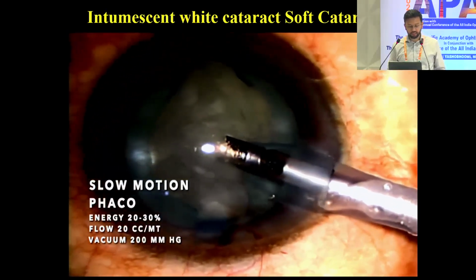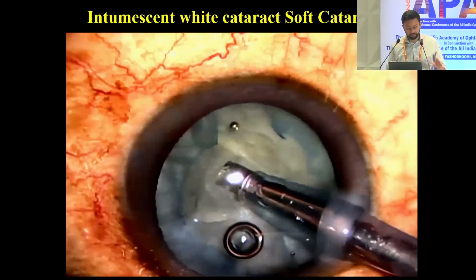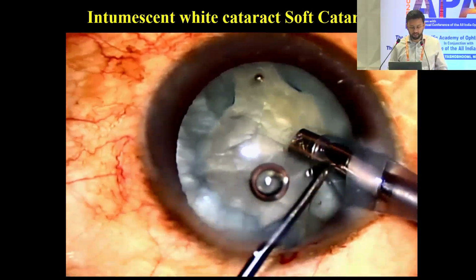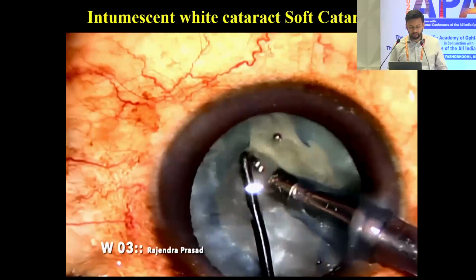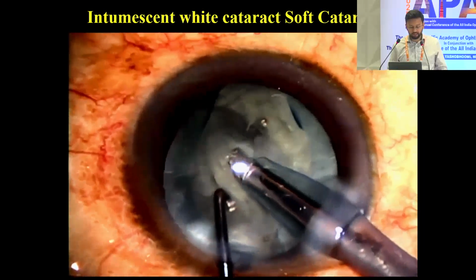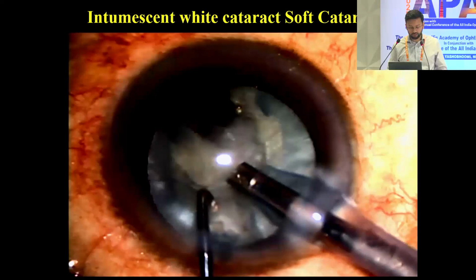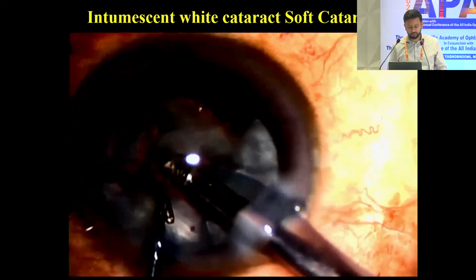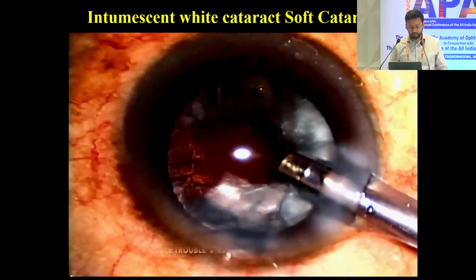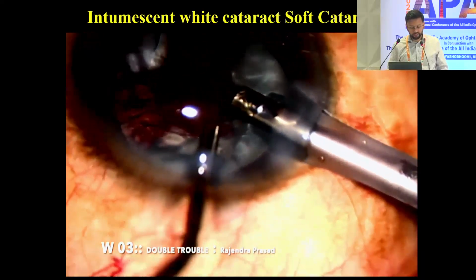The trick is doing phaco very slowly with slow parameters, but as this was a soft cataract, while attempting to chop, we realized that there was a double trouble in this case. We also created a posterior capsular tear here, and we realized it in time.